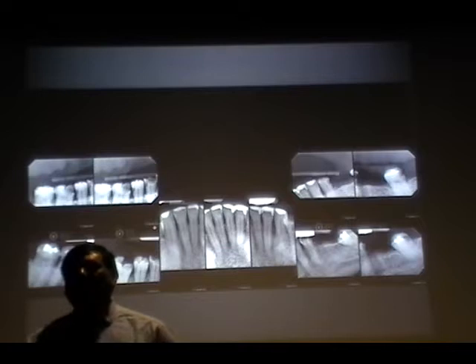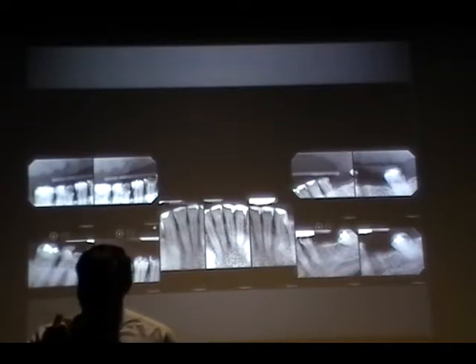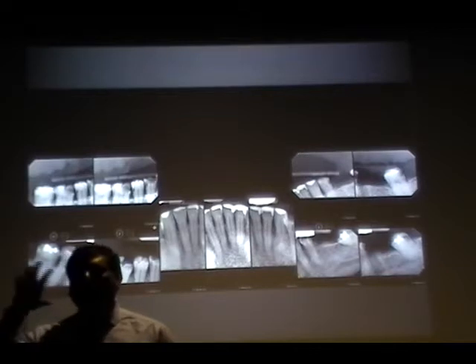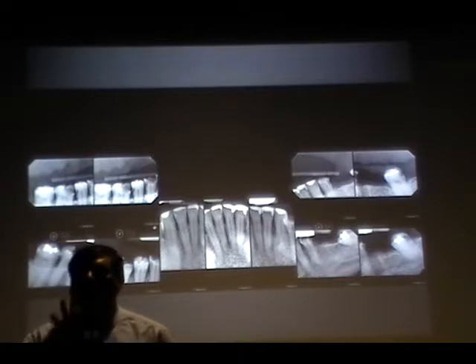Even if there is no second molar? If there is a missing molar, then there are always exceptions, right? So we could see if there is any missing tooth or root remnants on the panoramic radiogram. Depending on the situation, we may or may not require it, depending on the clinical situation.